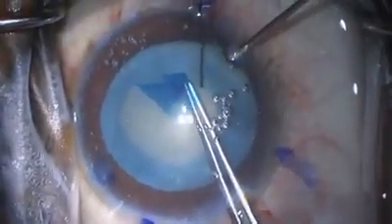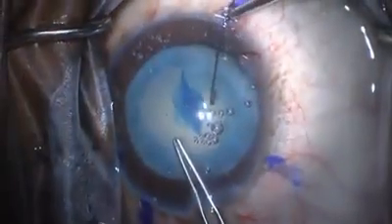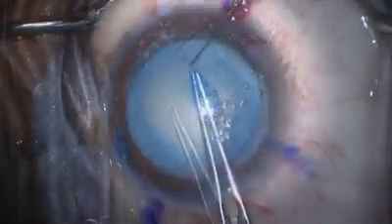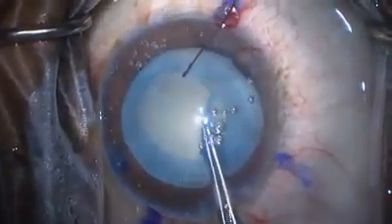When we come around the bend, we get it out of the way so we don't run into it. And just move that hook over as shown and complete the capsular rhexis.